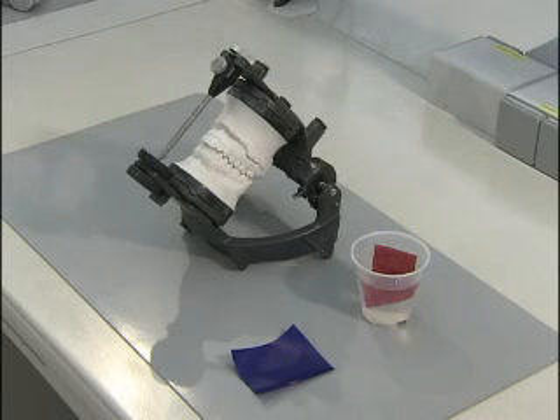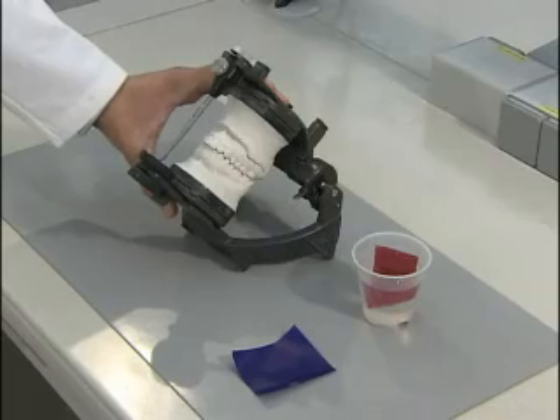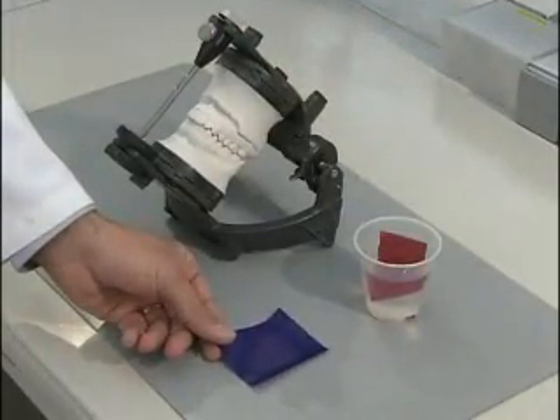Here's the armamentarium you'll need when setting up the articulator. You'll need articulated well-groomed study casts, you'll need your protrusive record, and you'll need a sheet of articulating film.